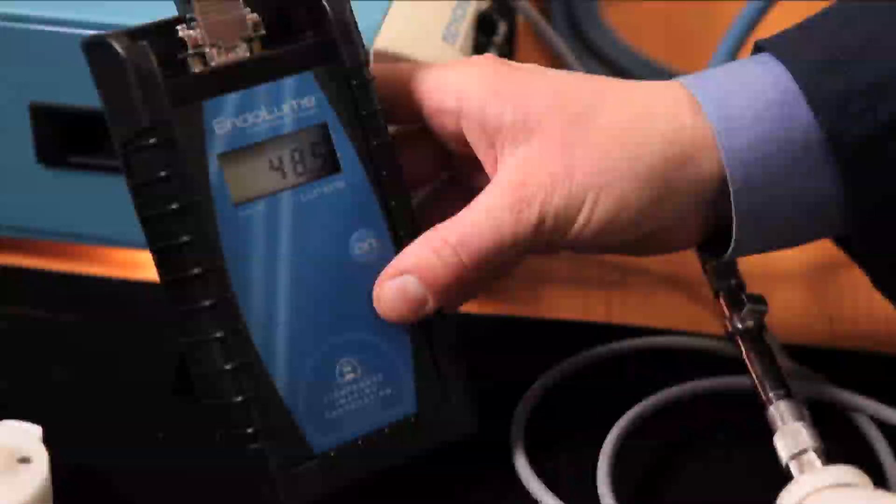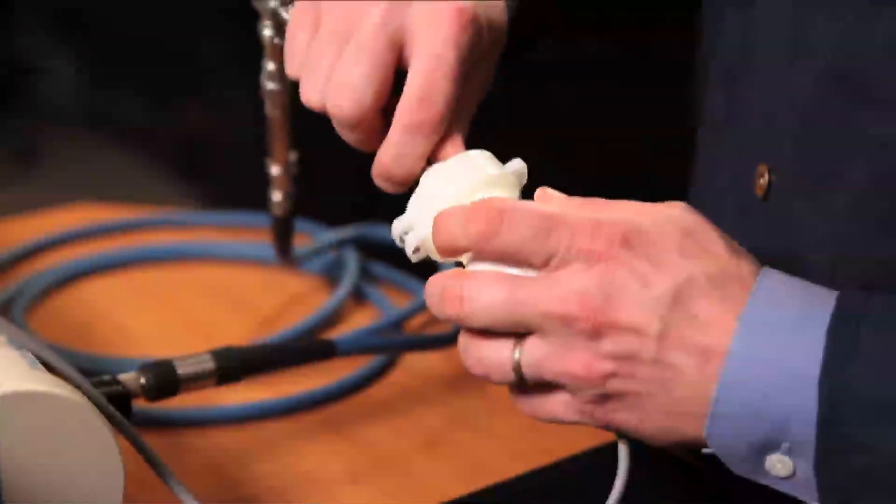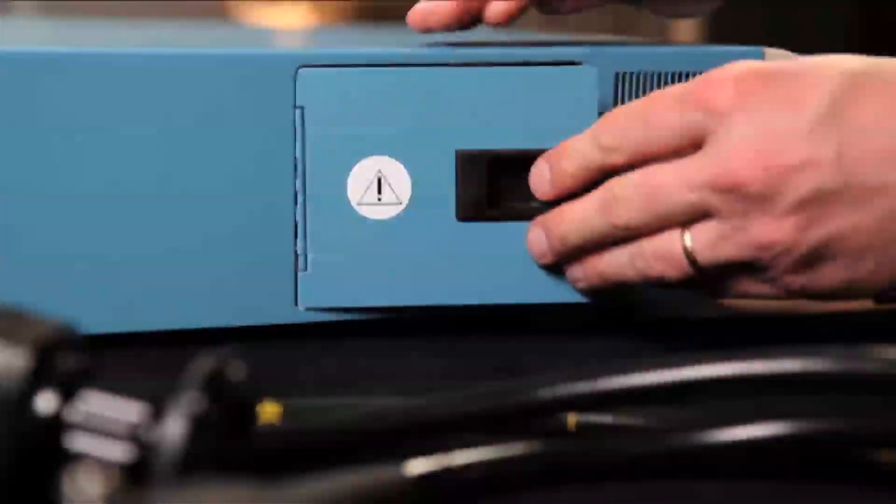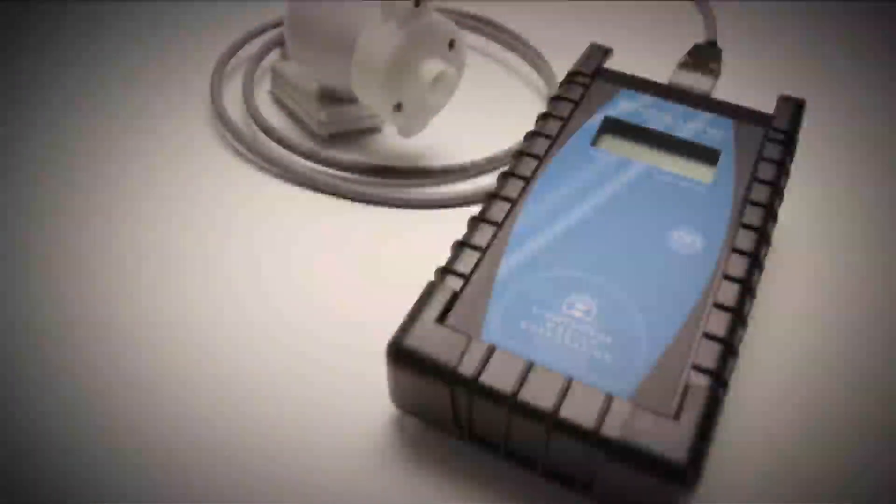With the Endolume, users can now establish evidence-based quality assurance for the hospital. Engineers and technicians can now use quantifiable measurements to manage endoscopic equipment. With the Endolume, the biomedical and clinical engineer can quickly isolate the source of an illumination problem and get the clinical staff back in business fast.